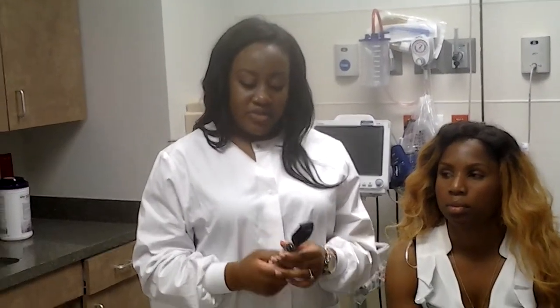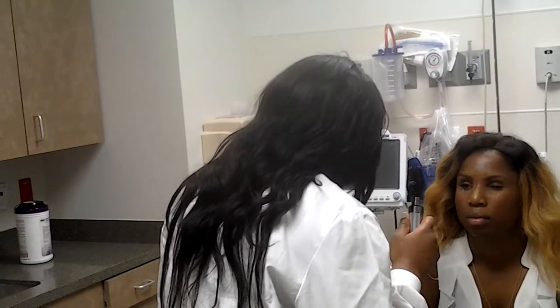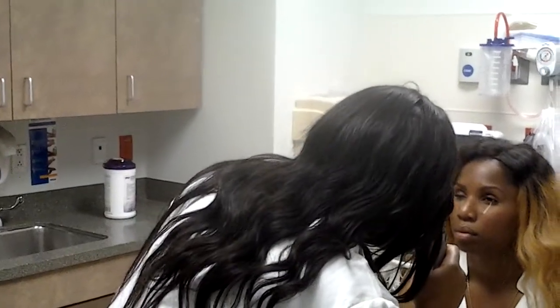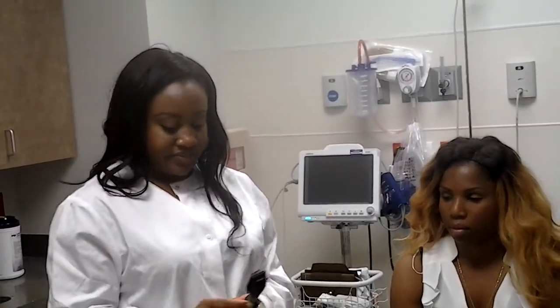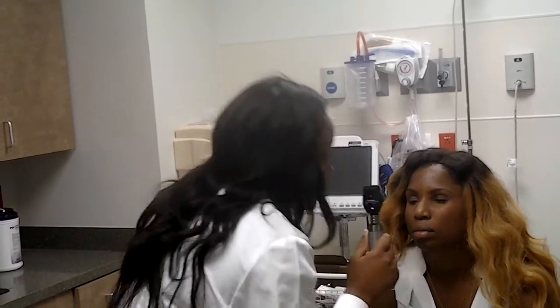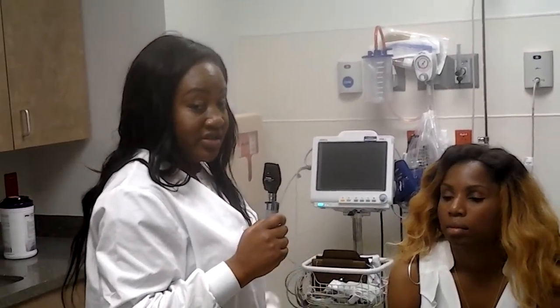Okay, so the next thing I'm going to do is look at the optic disc. Alright, the optic disc is yellow. There's no lesions noted. The optic disc on the other eye is yellow and there's no lesions noted. I'm going to go ahead and inspect the macula. I'm going to ask the patient to look directly into the light. Look directly into the light. Okay, I do see the dot of the macula. There's no lesions and there's no yellowing.